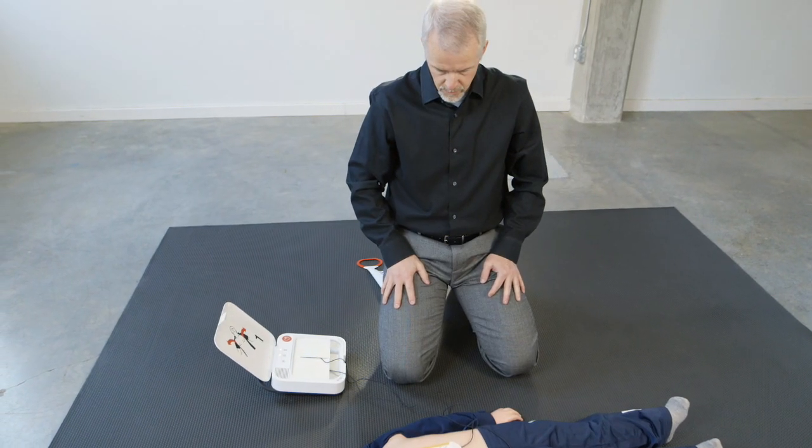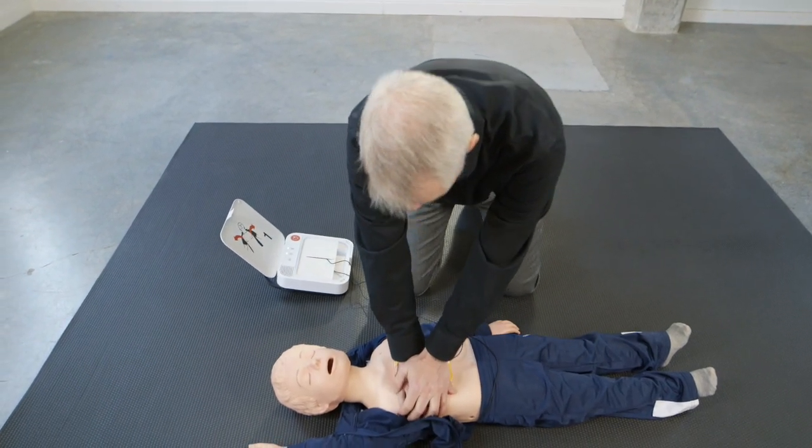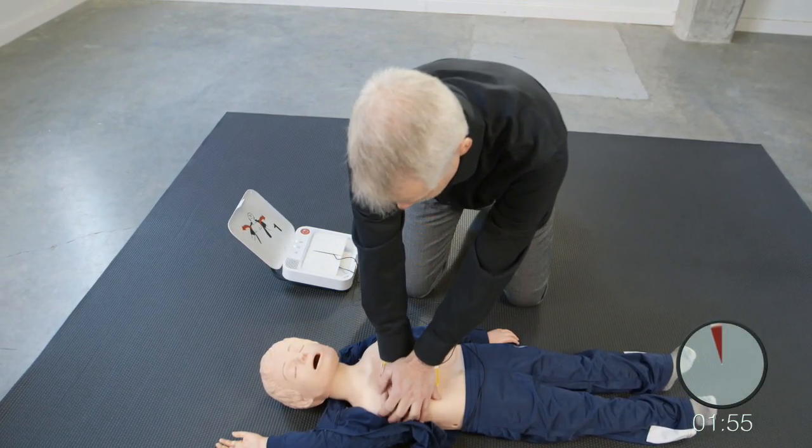Provide chest compressions to the beat. The heel of one hand should be in the centre of chest. The other hand should be on top of the first hand. Push down deep.